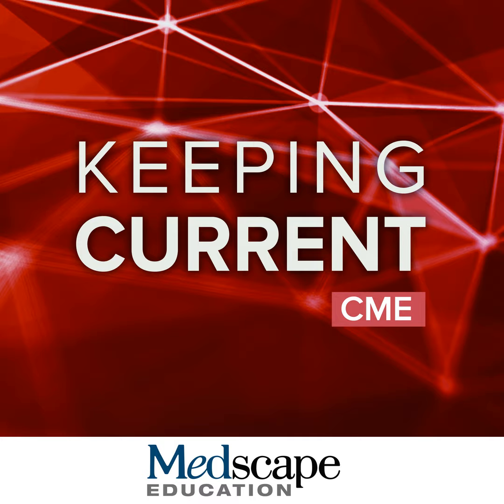FLIS of 3, now you can see that we have iso-enhancement of parenchyma to kidney and blood vessels, and now we have a little bit of excretion into intrahepatic ducts, but nothing goes out into extrahepatic ducts. Now we get into really poor function, FLIS of 2, 1, 0, 1. Again, we have no biliary excretion.